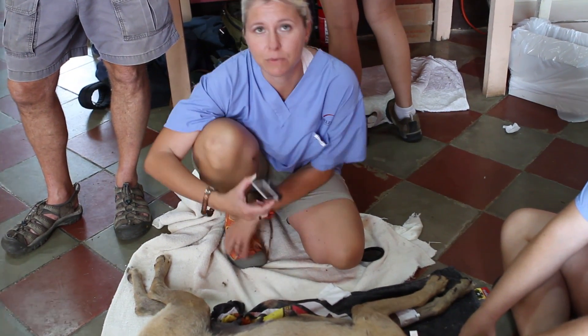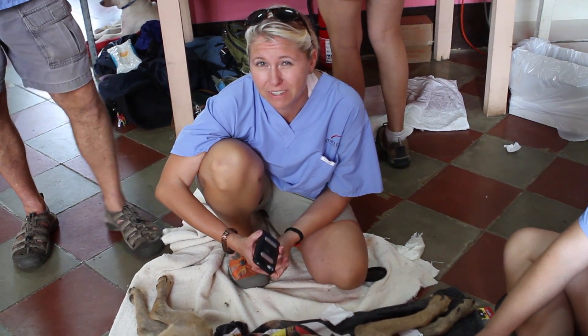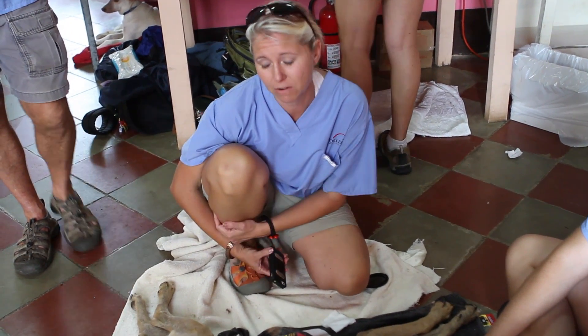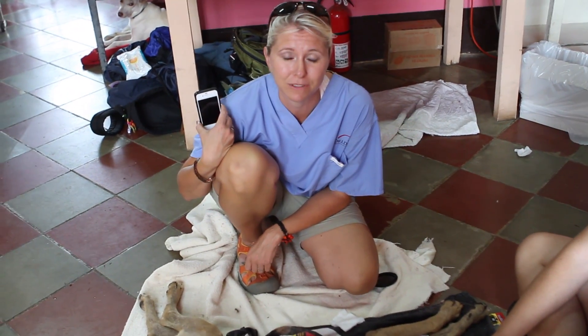It's superb for a situation like this where we don't have a freestanding ECG machine. We have a lot of dogs here that are street dogs and may already be compromised, so having the ability to get a reading is really valuable.